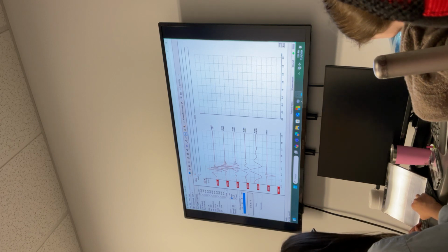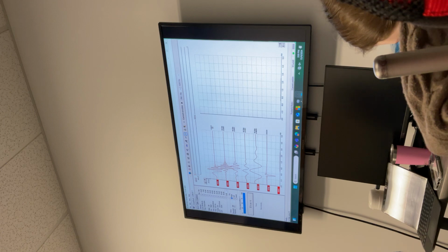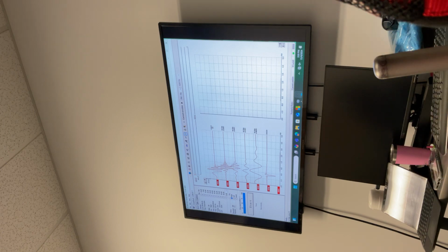The energy is between say 1,500 to 2,500. So 1,500 is presented here, then 2,000 hertz here, then again 2,500 hertz here. The same with 500 hertz. You said there's compensation for the traveling wave, is that what you said? Yeah, within those narrow range of frequency, there's traveling wave compensation going on.